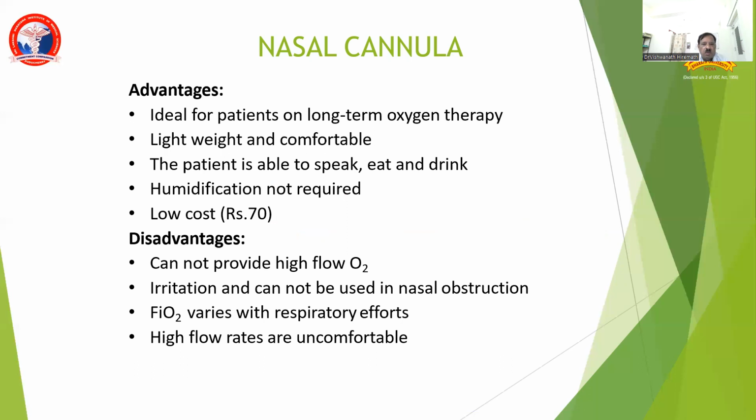Low weight, comfortable. Patient can eat, drink, and move. Cost is low. Disadvantage: cannot provide high flow oxygen. Cannot be used in nasal obstruction. FiO2 achieved varies with the patient's respiratory effort. High flow rates are uncomfortable.